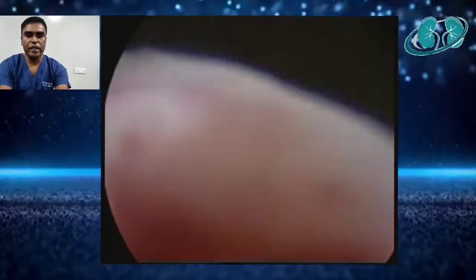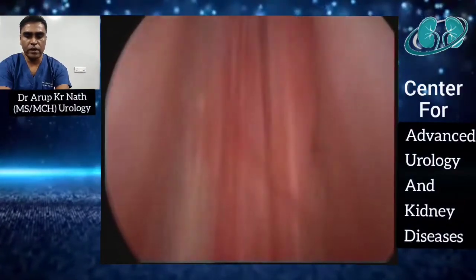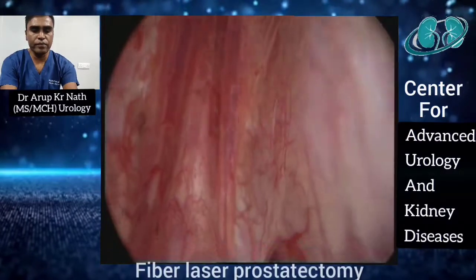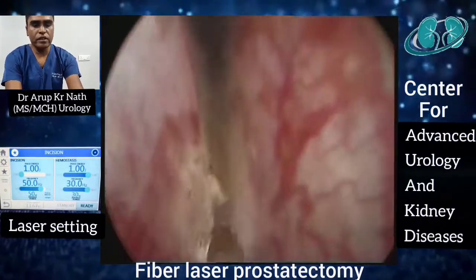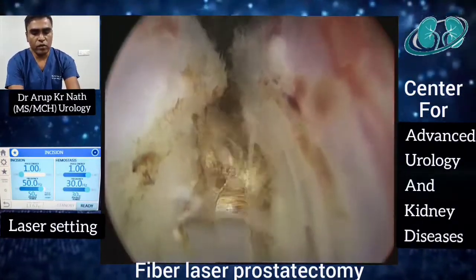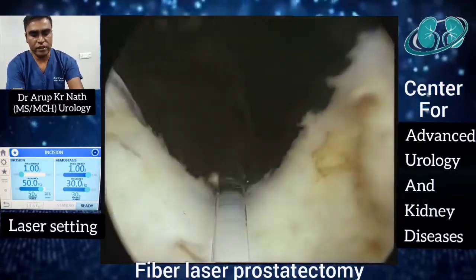Patient is under spinal anesthesia in lithotomy position. This is the initial cystoscopy. You can see the enlarged median lobe and this is the verumontanum. Laser energy is kept at 50 hertz 1 joule for incision and 30 hertz 1 joule for hemostasis.